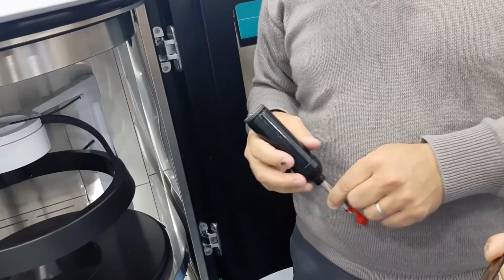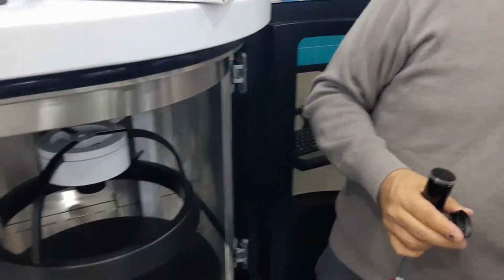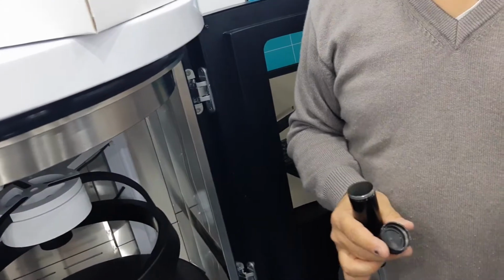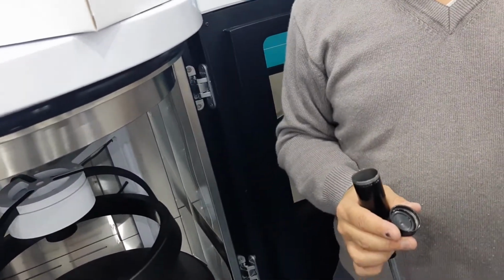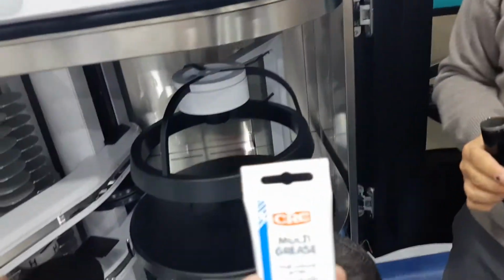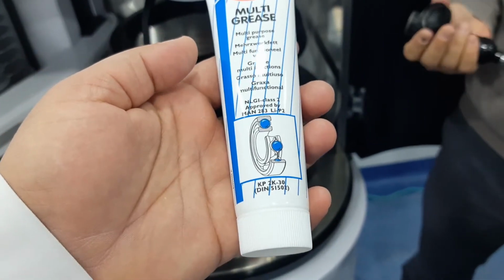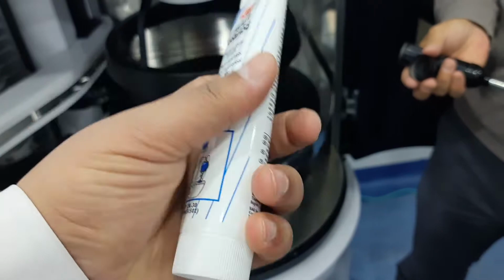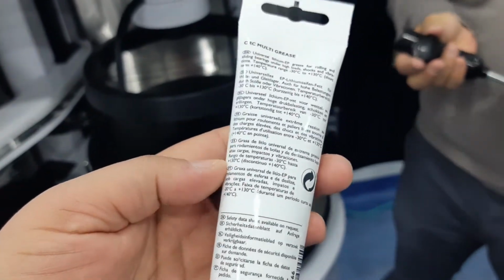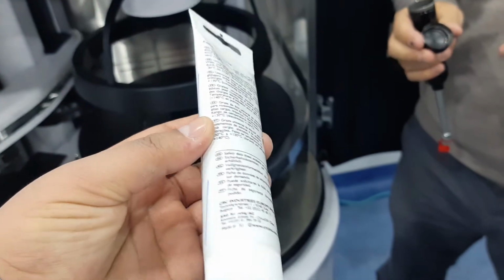That's a small pump. Temperature range is minus 30 to 130, short term 140 centigrade. It's universal, but it must be with the same specification. You should add 1 gram in each point. It looks easy like that, but it's not easy actually.